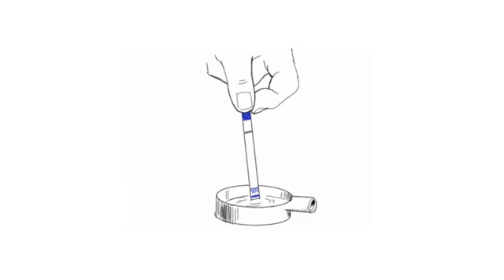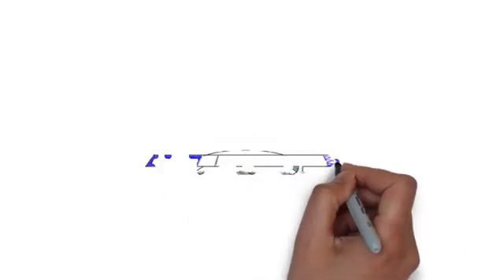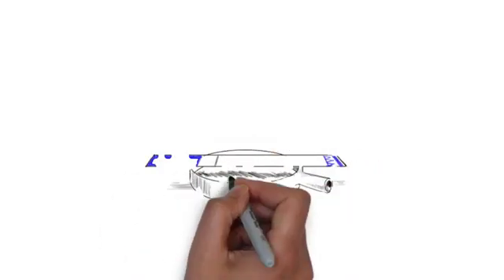Open a test strip and be sure to hold it by the top. Dip it into the cooker and keep it there for about 15 seconds. Afterwards, lay it across the top of the cooker and wait for the results to appear. They happen pretty fast, usually in less than 30 seconds.